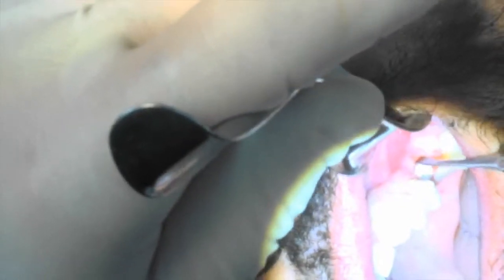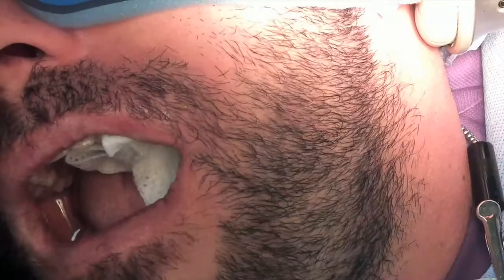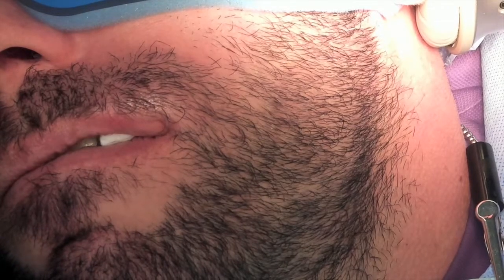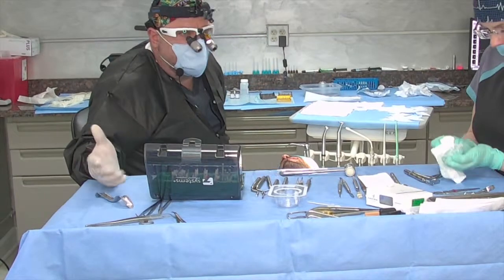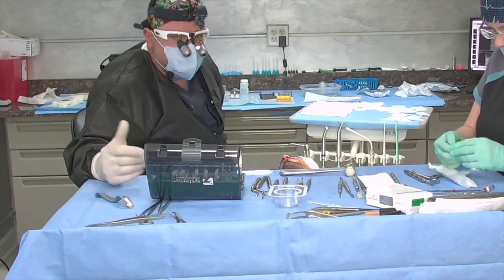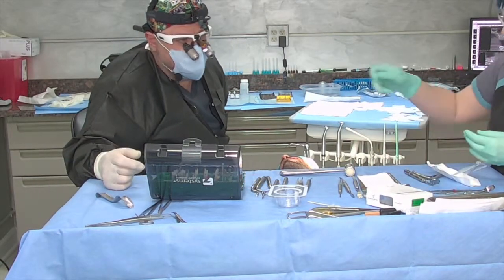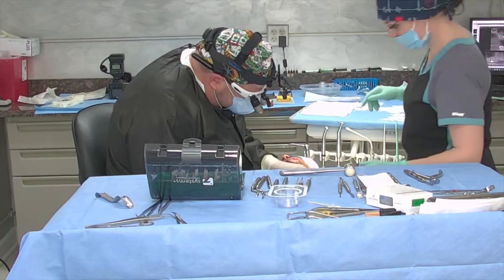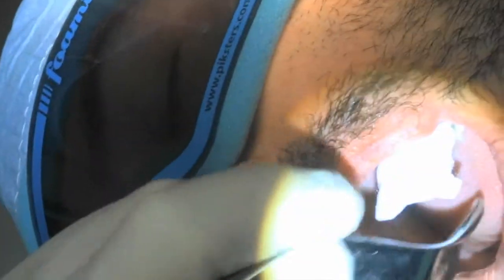So what we're going to do now is Ina's going to give me a little healing cap. The short one, please. Can you bite down, Matt? Yeah. We got great torque on the implant. So this implant, at 45 newton centimeters, could go more. We could have a temporary put on. You could put a provisional restoration if you wanted to. You could put your final abutment in. If you have a Cerec, you could make a final crown today with this kind of torque. So here's our little healing cap we're going to put in over the site of the implant. Okay, you can take out. Gloves, please. Thank you.